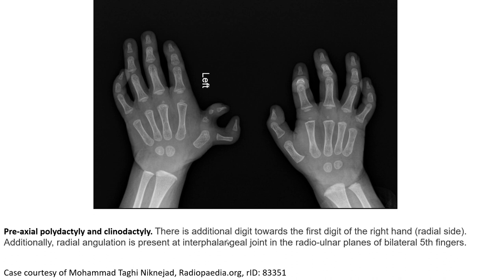Another example of preaxial polydactyly and clinodactyly. There is an additional digit towards the first digit of the right hand. Additionally, radial angulation is present at the interphalangeal joint in the radio-ulnar plane of the bilateral fifth finger. Thank you.